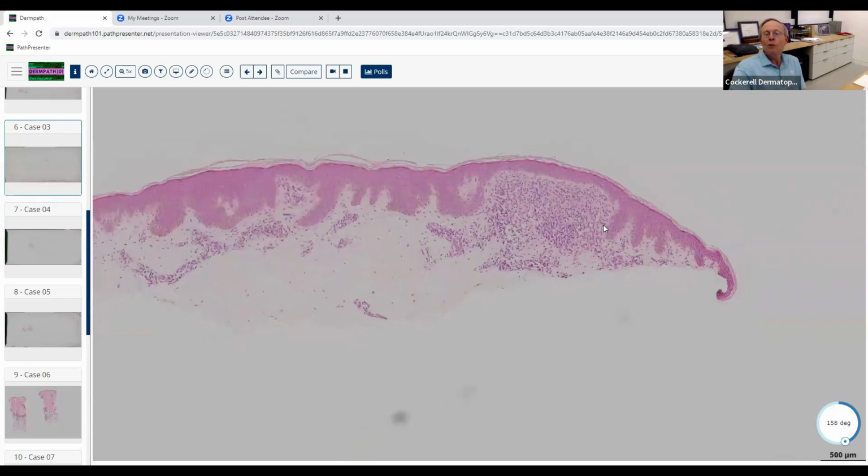So what disease do you know that gives you a small nodular aggregation of histiocytes in the papillary dermis with a ball and claw morphology? Some people even refer to it as a lichenoid granulomatous inflammation because it's sort of forming a little band-like infiltrate of histiocytes, and it does sort of involve the DE junction here.